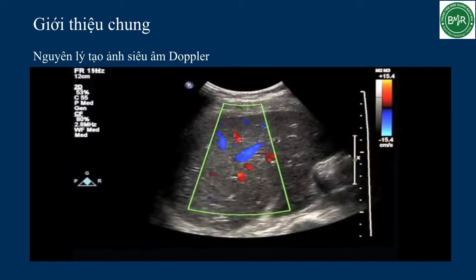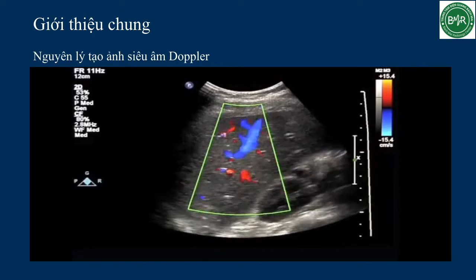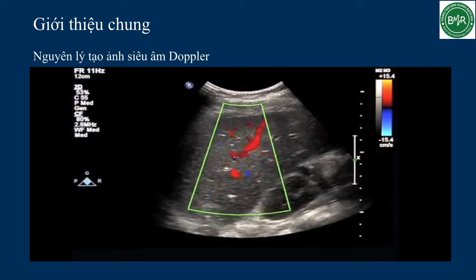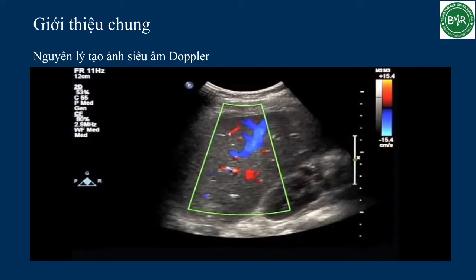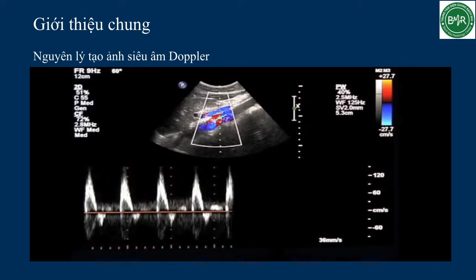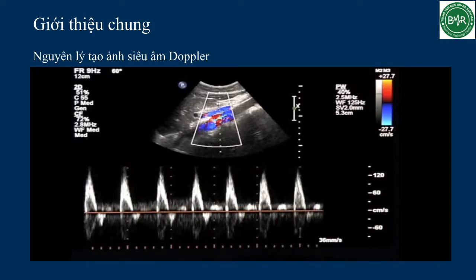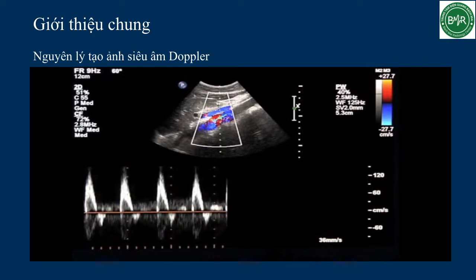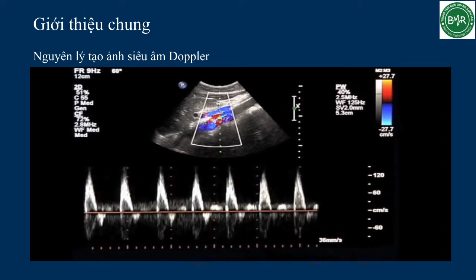Pulsed wave Doppler is primarily used for the rest of the vascular system, as the round-trip effect enables a greater accuracy about location rather than just blood speed. Whereas color Doppler is used to assess patency and blood flow, spectral Doppler, or spectral analysis, is used to quantify the amount of blood flow and resistance.